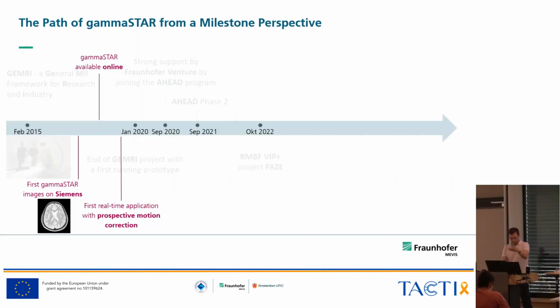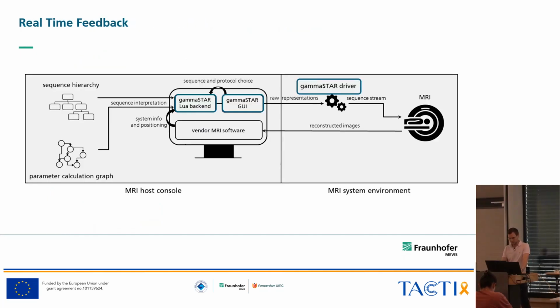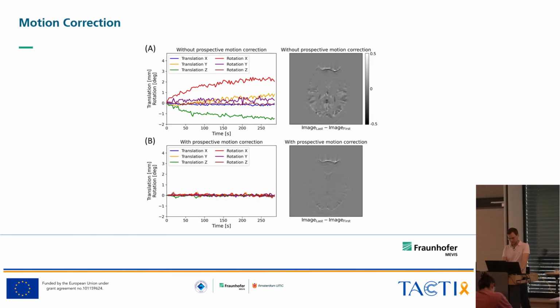Yeah, as I said, 2018 I joined the project, and then my task was to make it possible to also acquire images in real time, have prospective motion correction applied and different real-time interactions to the MR sequence. So if you look at these results, it's basically what Jörn showed with a subject in the scanner moving throughout the time of the scan, and then you try to follow the subject with your imaging plane.